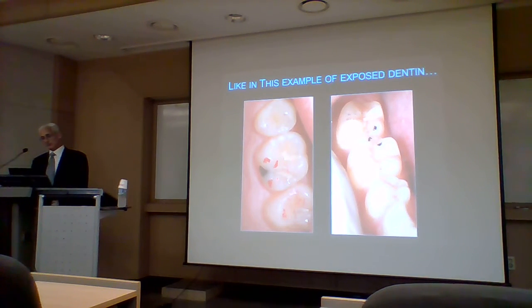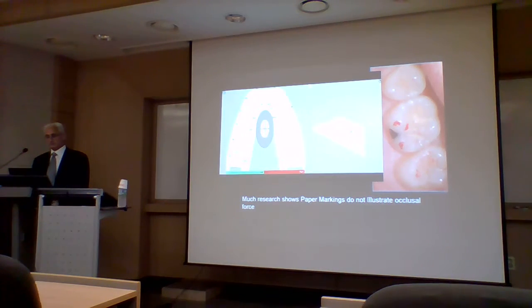We have 3 large marks, exposed dentin, small paper marks, counterpart 3 large marks, exposed dentin. But here's the case when measured with the T-scan.